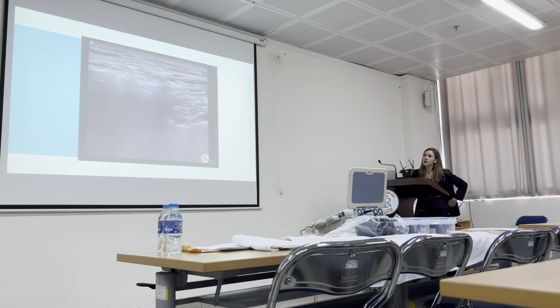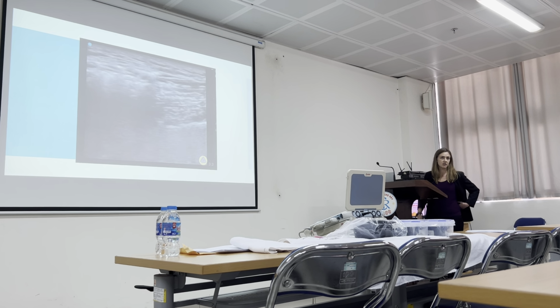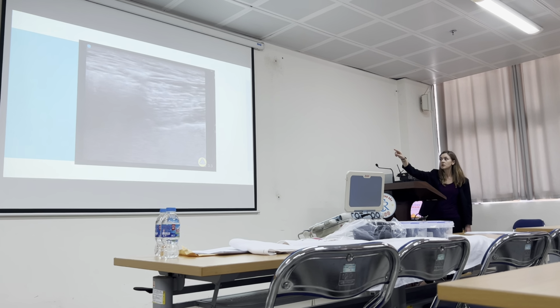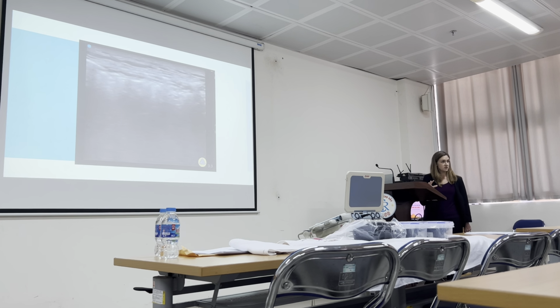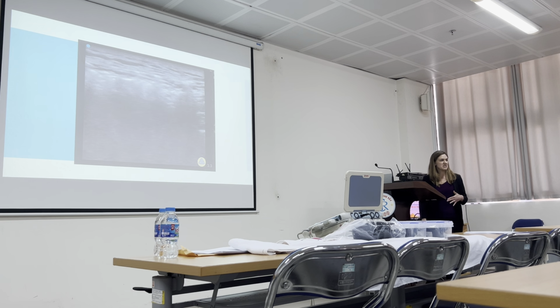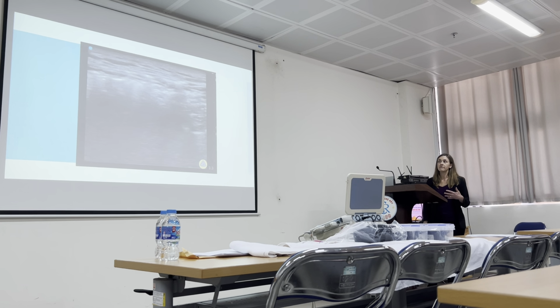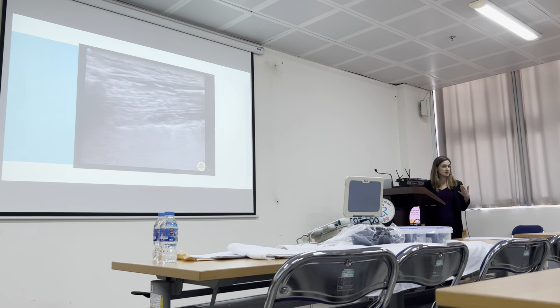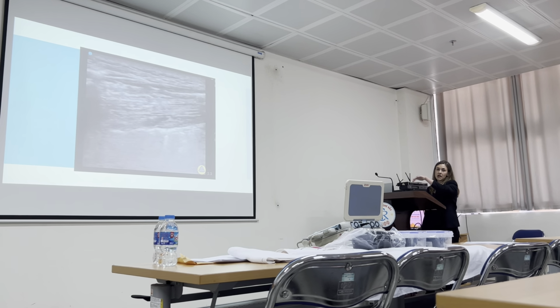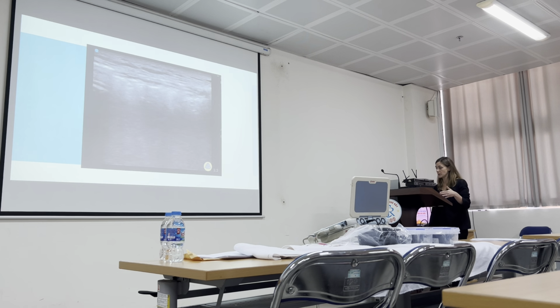But you need to be careful with this because you don't need air in the tissue to diagnose necrotizing fasciitis. At the beginning, you might see just the layering of fluid. So when someone comes into you and says, my leg really hurts, and you've decided to put an ultrasound on it because the pain is kind of out of proportion to what you would expect for a cellulitis, and you see just some fluid around it, and you think, oh, this might just be edema, because I don't see any of those bright white lights indicating air. It just might mean that it's not late enough in the course for you to develop that air there.